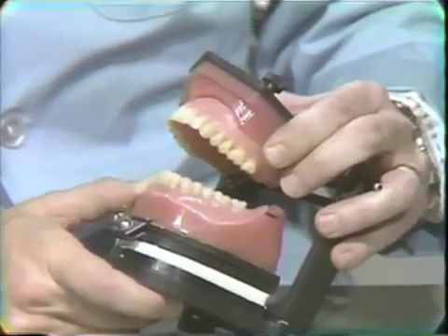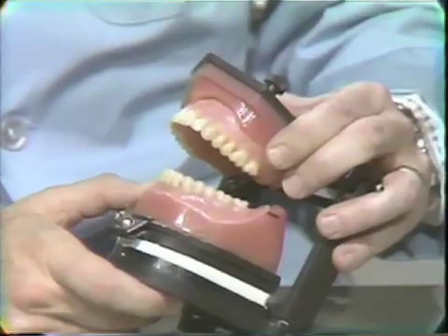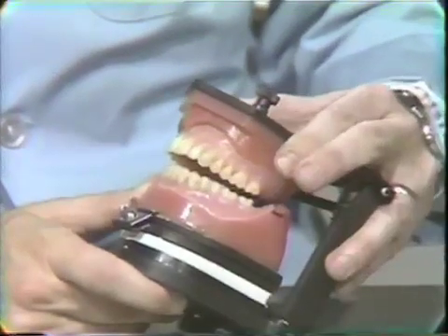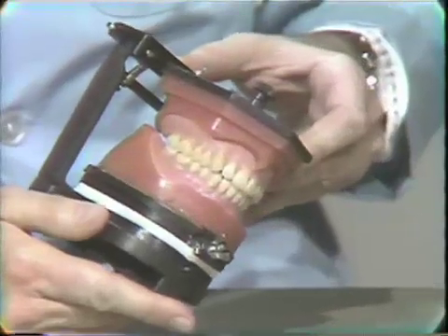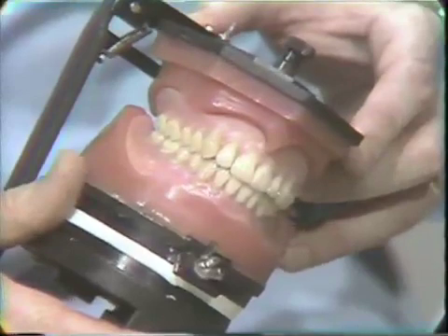We don't want the tissues to adapt to occlusal differences. We want the occlusion to be absolutely perfect before the patient starts wearing the denture. Because unfortunately, tissue will adapt to some occlusal discrepancies, and this is to the detriment of the tissue ultimately.